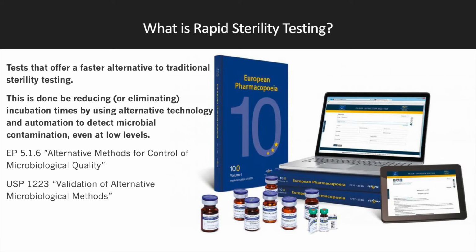So rapid sterility testing is acknowledged by both the European and the US pharmacopoeias in these chapters here. And it was actually first acknowledged by the European Pharmacopoeia in 2006. However, it's still not as standard, and as such, finding the correct rapid test for your product and validating it by equivalence testing with the traditional method is very important.